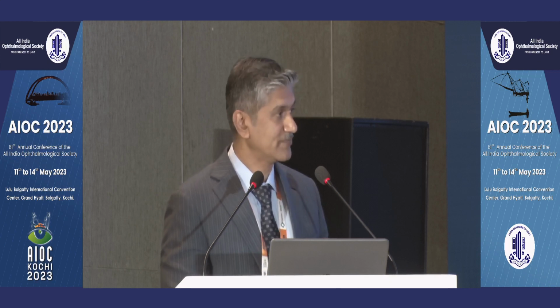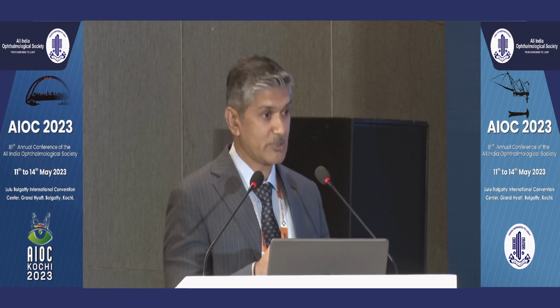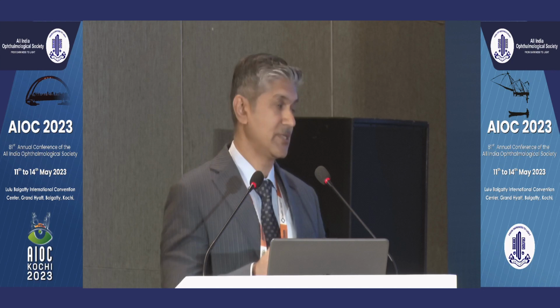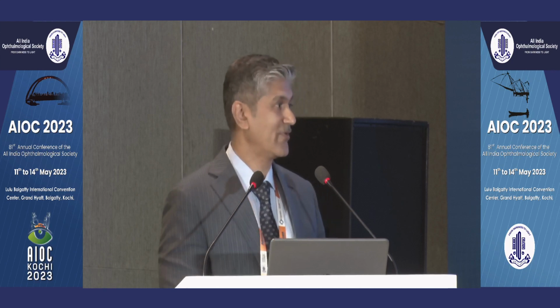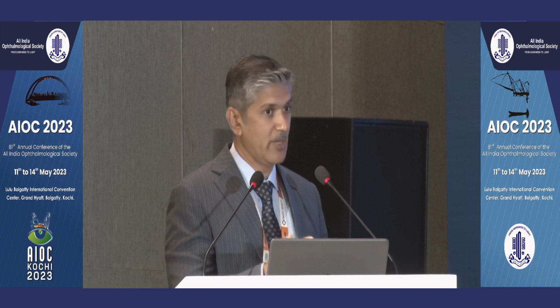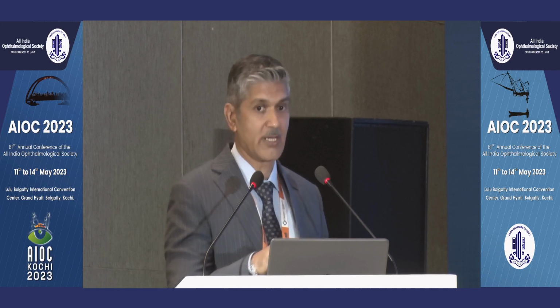And do you use the full cycloplegic refraction even in younger patients, or do you tend to undercorrect slightly? No, there is a nomogram which actually overcorrects because of the regression. But even using that nomogram, they found that there is some amount of late regression. So what happens is, in these young patients, when we use the nomogram, initially we see that they are a little overcorrected, but by about 3 months, they stabilize.